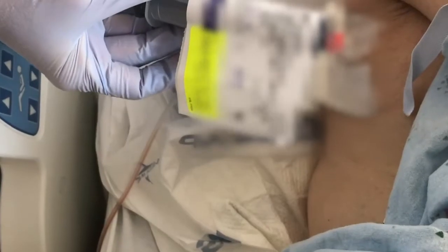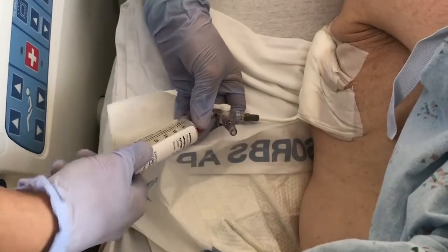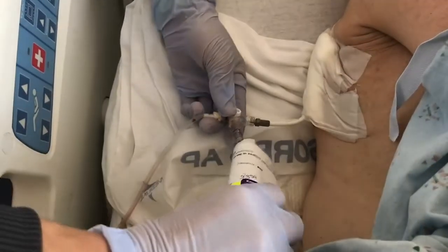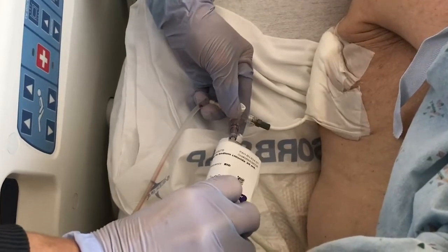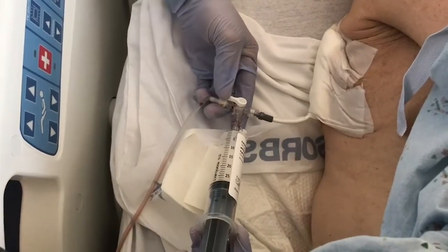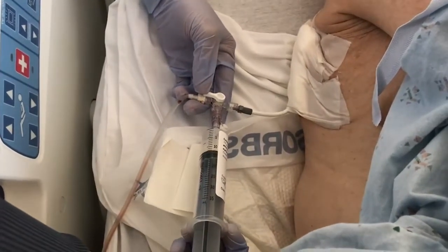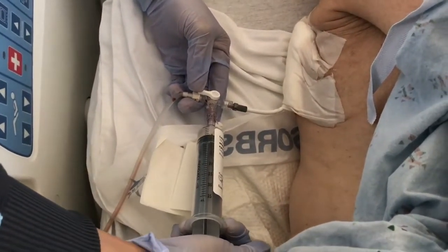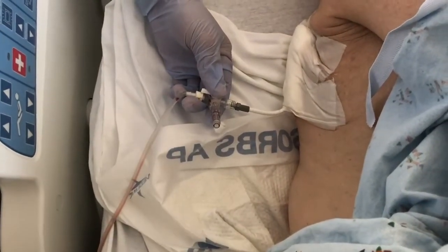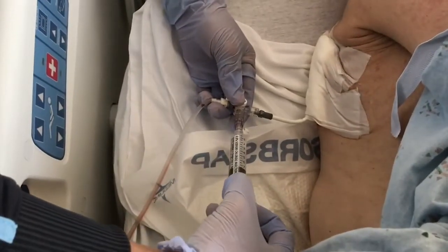That was the pulmozyme, and now we're going to instill the TPA. Again, it does not matter in what type of sequence they get instilled. You just follow that with one final flush to make sure it goes through the catheter.